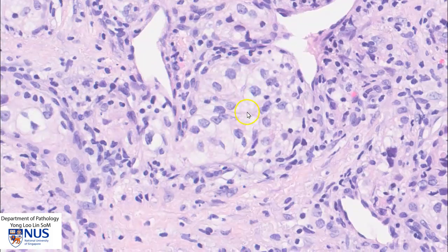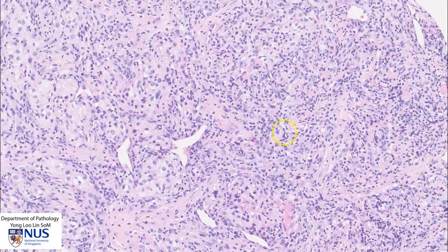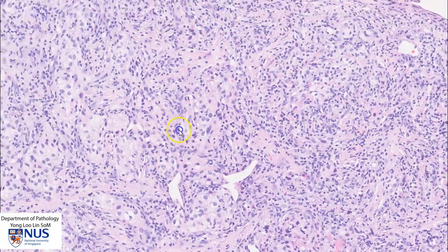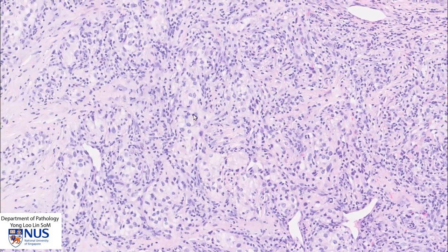Therefore, we are dealing most likely with a malignant clear cell tumor, and in this instance, the top differential diagnosis is metastatic renal cell carcinoma. Clear cell renal cell carcinoma has the propensity to metastasize to unusual sites, including the skin. Sometimes it can also metastasize to visceral sites, for example the thyroid gland, and metastases can occur many years after the original diagnosis.